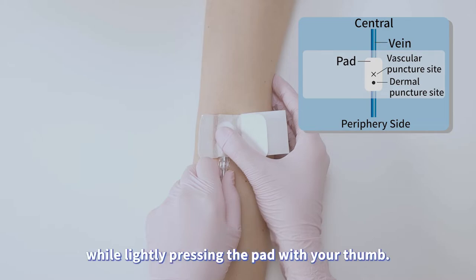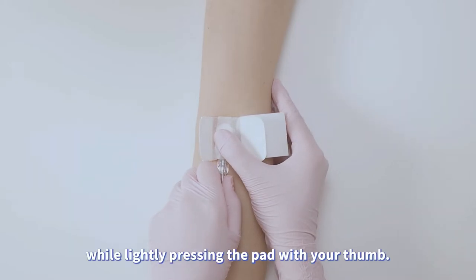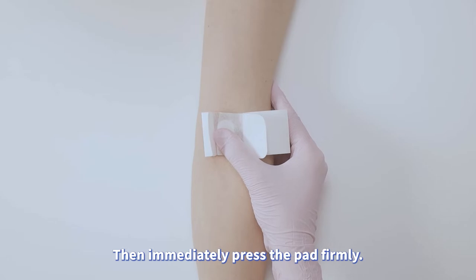Remove the needle or catheter while lightly pressing the pad with your thumb. Then immediately press the pad firmly.